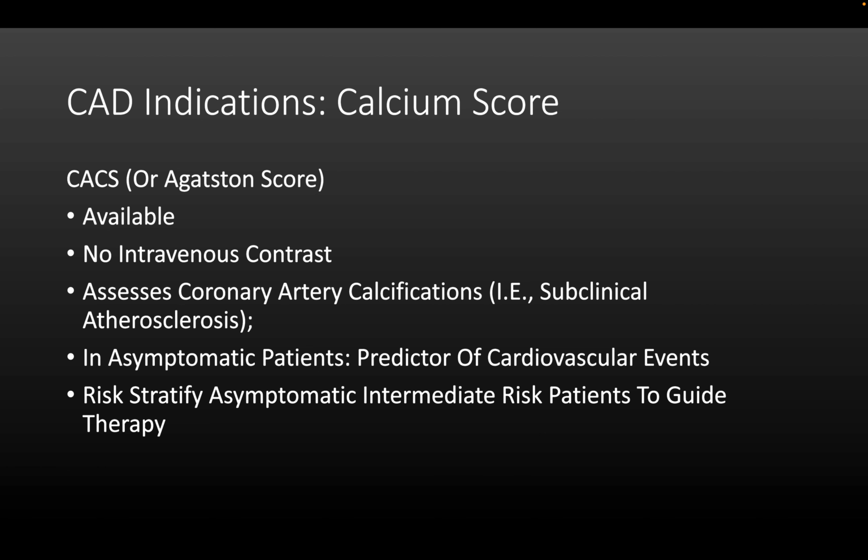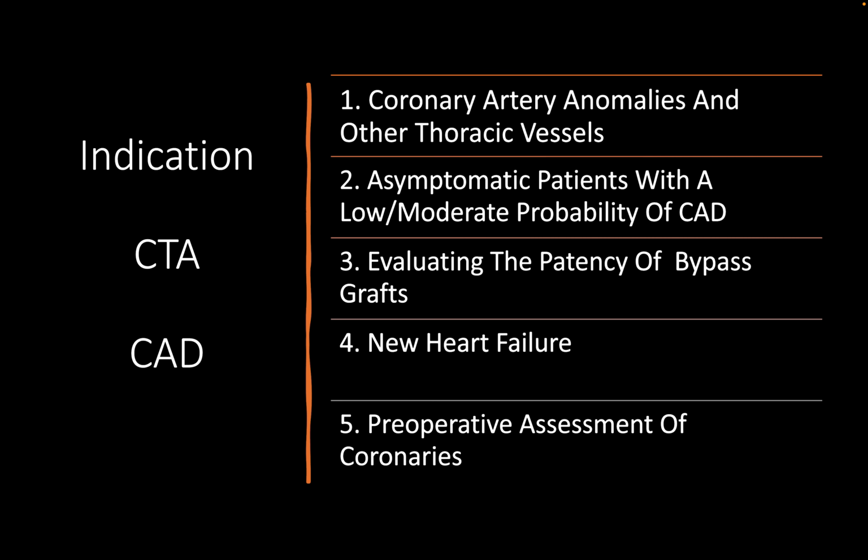Some of the institutes in young patients would do the calcium score. If negative, they will not proceed to the CT angiography. However, if it's positive, then there is a threshold of what's mild, moderate, and severe. So there is a scoring system in order to guide the management and the medication or the therapy.